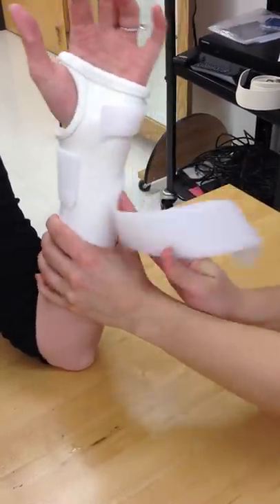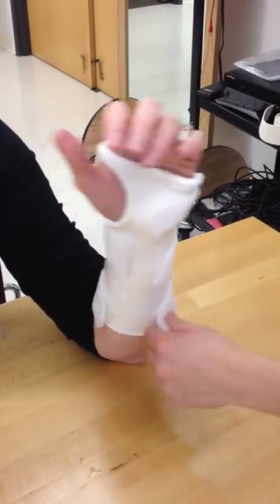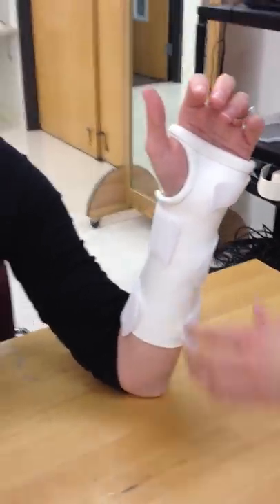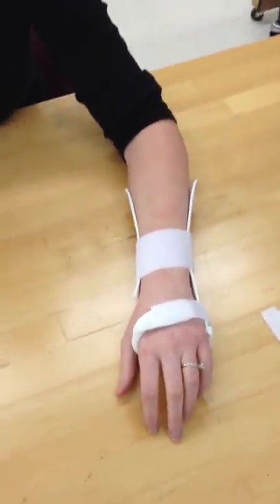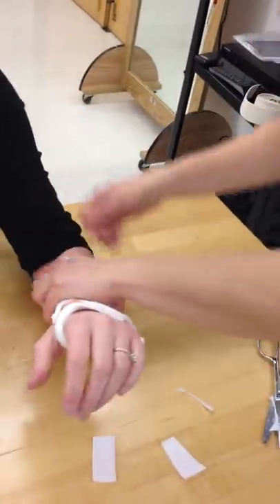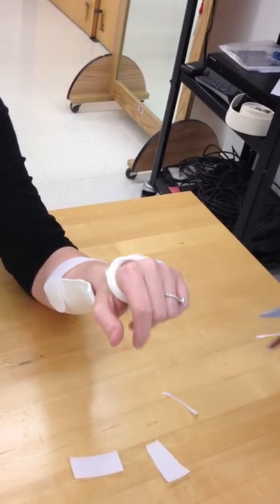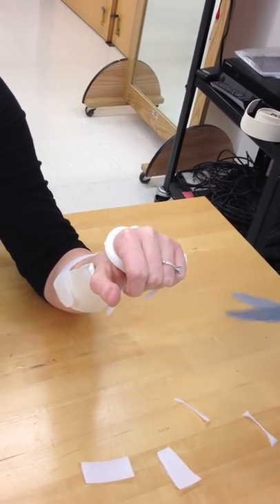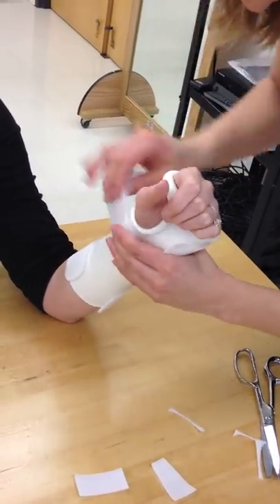Once you get this on your patient, they'll really be able to tell you if there's any spot that's going to bother them. You always want your patient to wear your splint for a good 10 to 15 minutes while they're in the clinic, to see if there are areas that are going to irritate them — so you can modify it before you send them home, rather than having a sore spot the next time they see you.